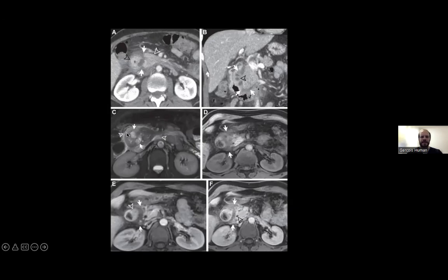This is the MRI imaging in the middle and lower aspect. This being T2, we can see these rounded, high signal intensity, fluid-like regions, which are the cysts. This is an uncontrasted T1 image, and then on early arterial enhancement, you can see the contrast in the aorta. It's low signal, meaning it doesn't show early enhancement, but it corresponds to this region of low signal intensity on the CT.